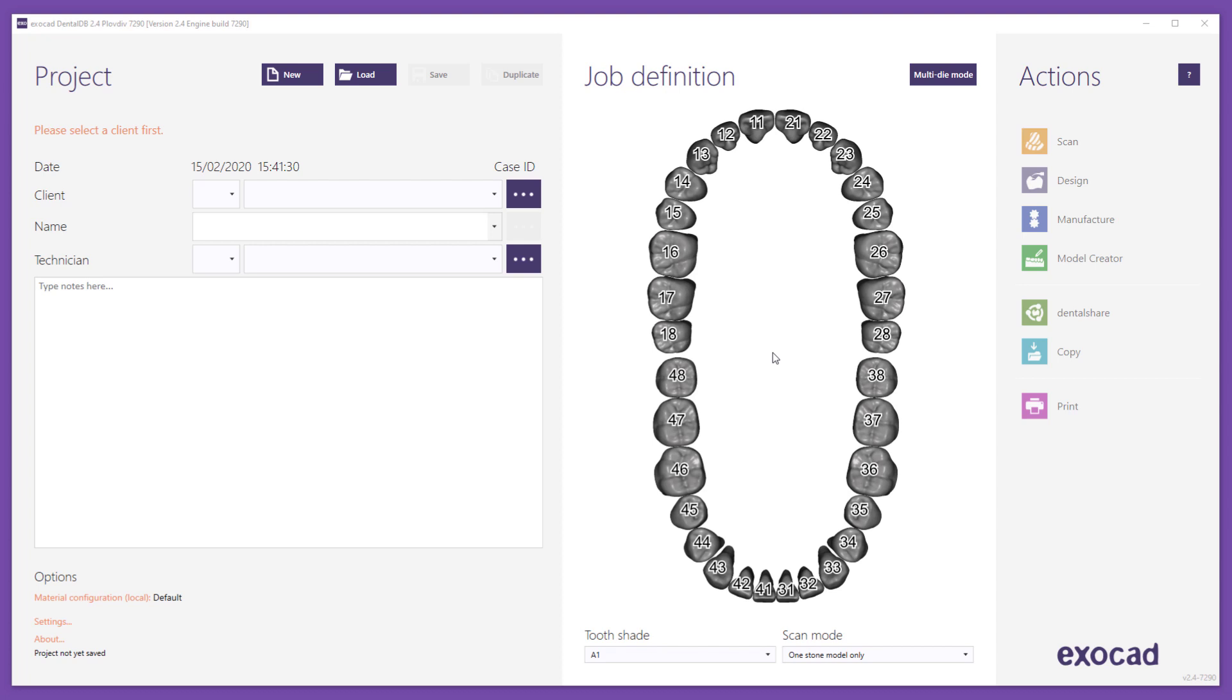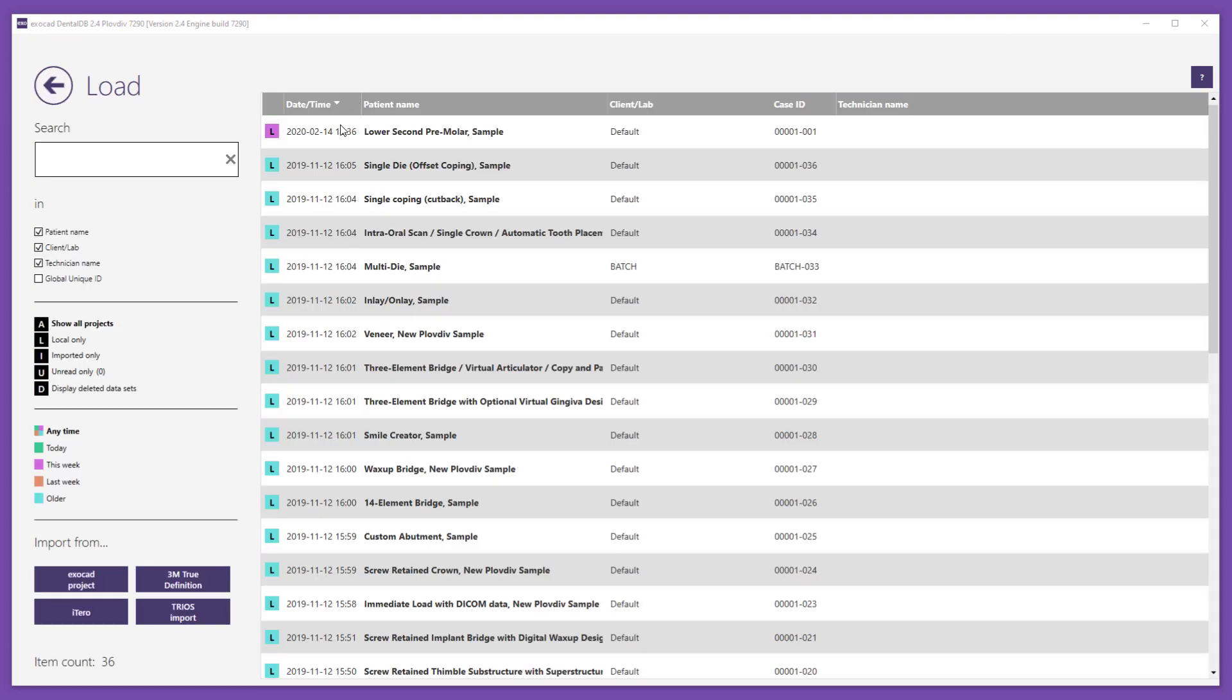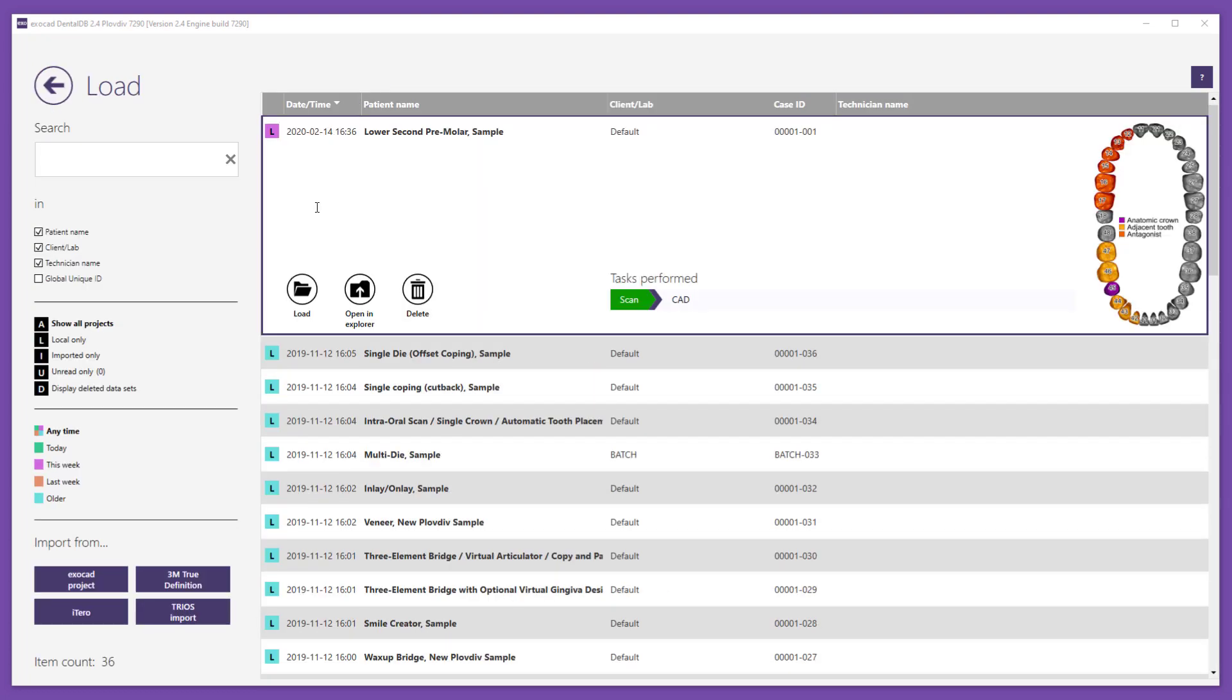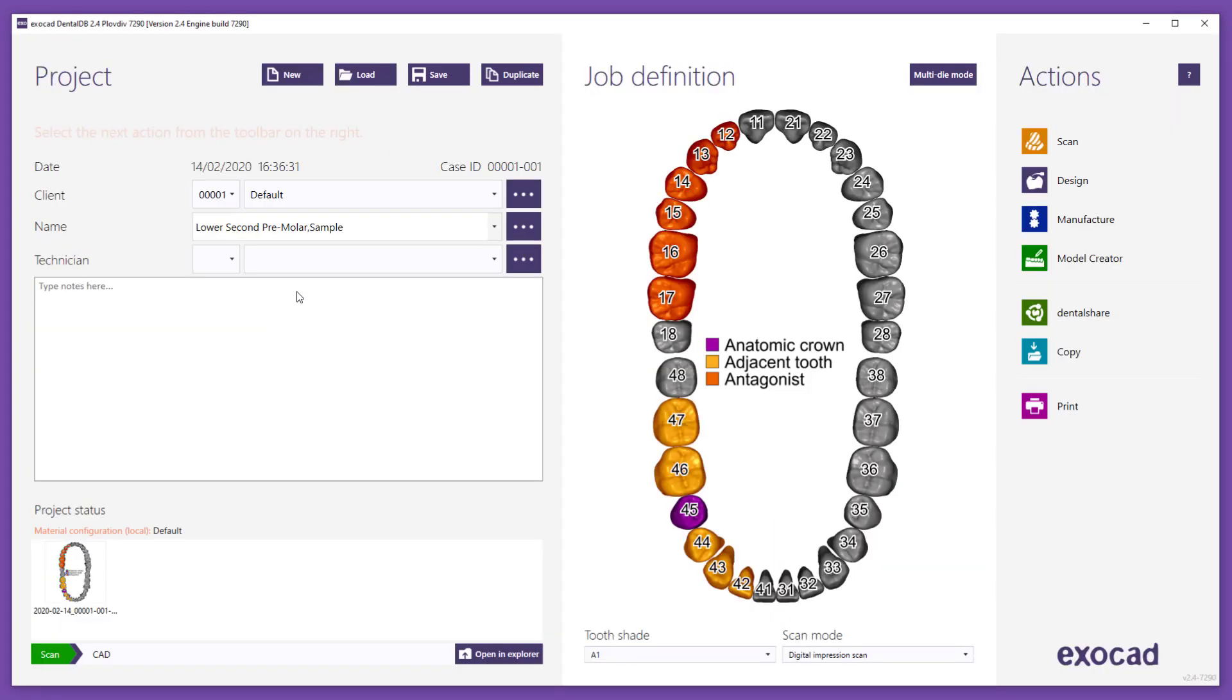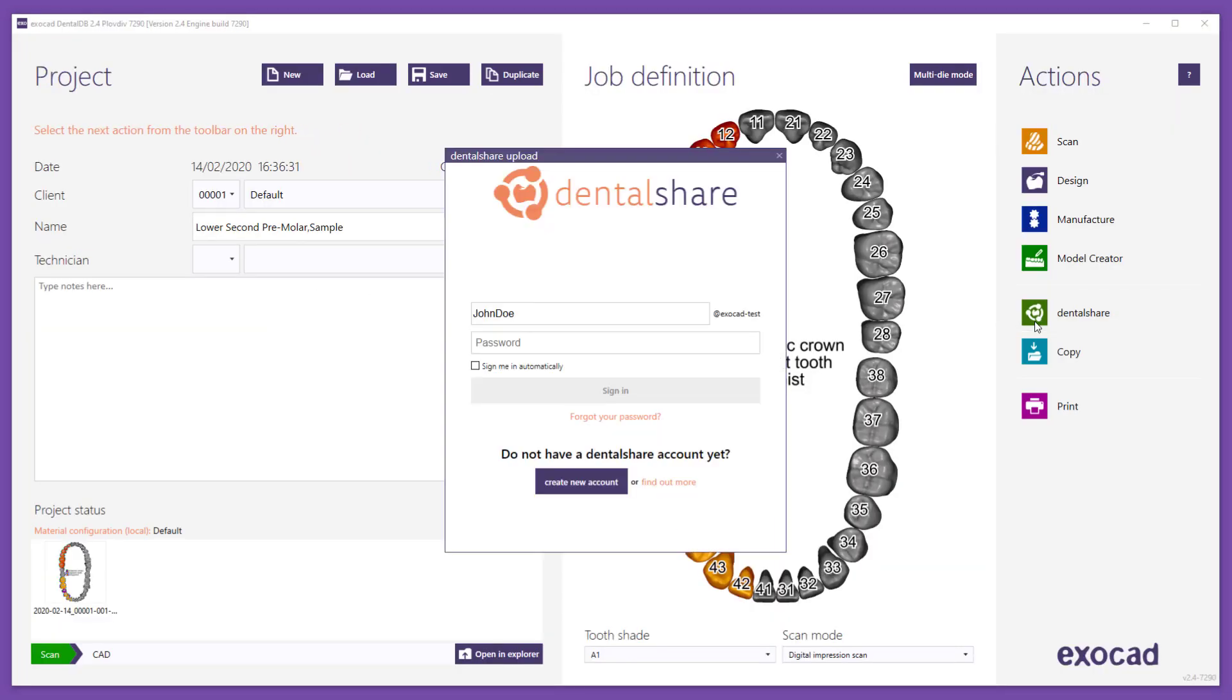To start, launch ExoCAD DentalDB. Load an existing job. In the Actions section, click the DentalShare button. This opens the DentalShare upload window.